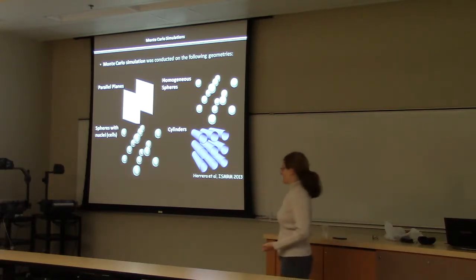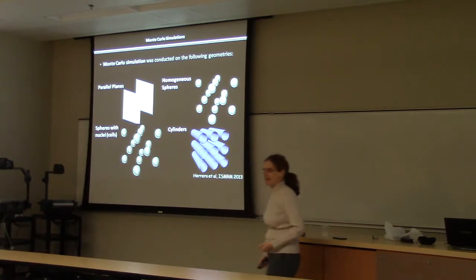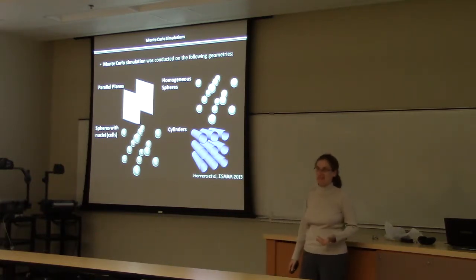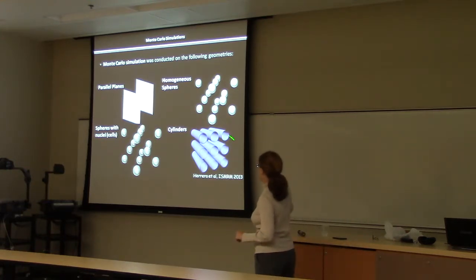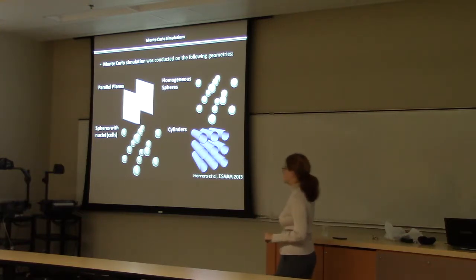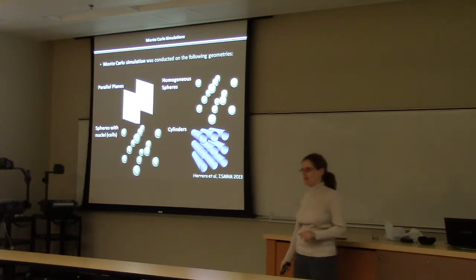Trevor and Cheryl went crazy and they put cell nuclei in each of these cells to see if we can have complicated structures and actually see differences in the signal. And I'll show you that. We're getting there, but we don't have a formula for it yet. And then this is our model of our axons. So we've got these tubes that are like nerve axons. We've got water in them and around them. And we're trying to figure out if we can find the diameter of those tubes.